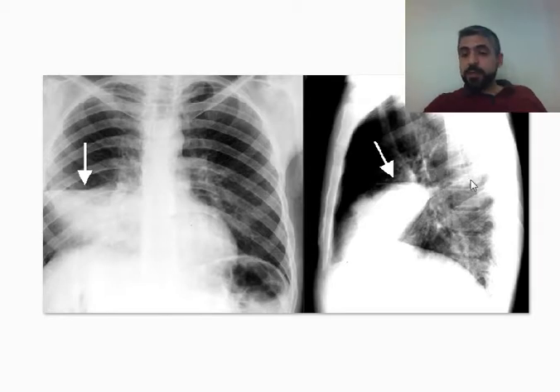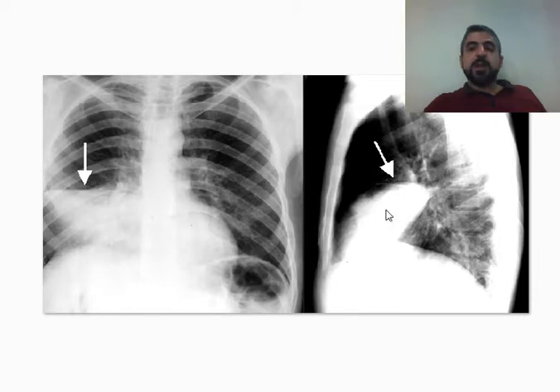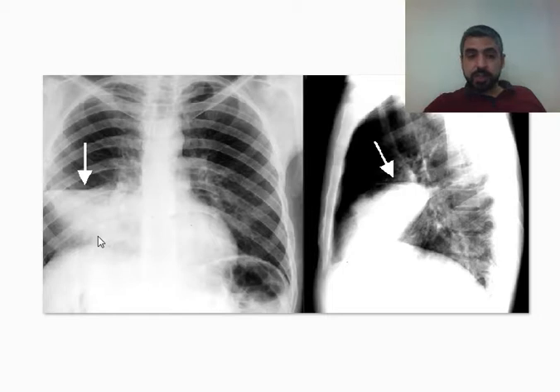On the lateral view, you can easily appreciate the middle lobe between the transverse fissure superiorly and the oblique fissure inferiorly. This is the lower lung lobe and this is the upper lung lobe. The right middle lobe is dense, indicating it is consolidated. No signs of volume loss are seen — it is still in its place — indicating consolidation, not collapse.